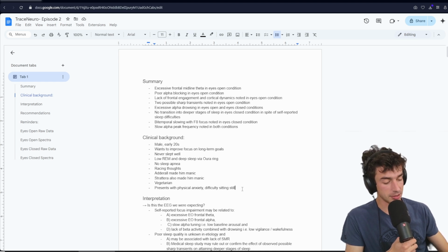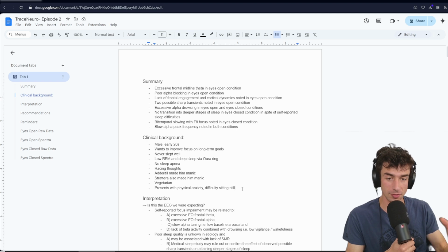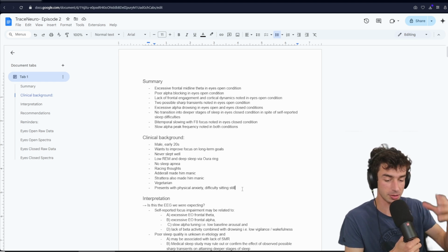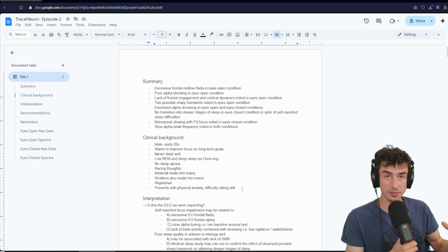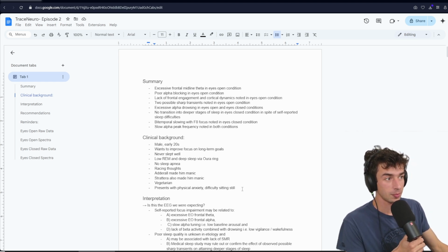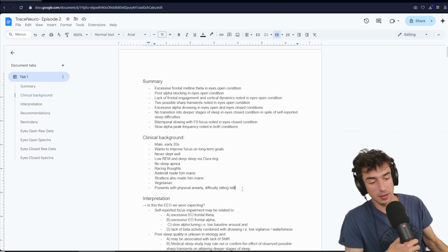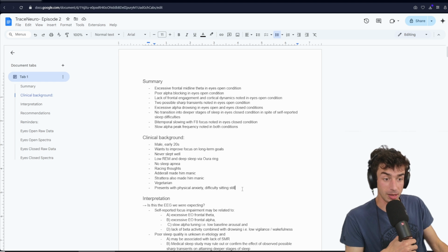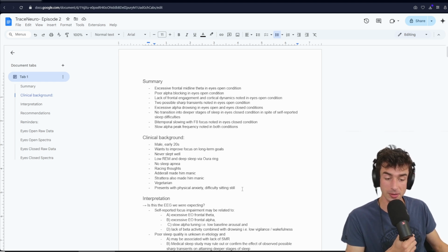And I remember Dave Seaver talking about this early on in my own EEG and neurofeedback journey, of seeing people with this kind of presentation where there might be too much alpha and/or theta up front, where they present as being very anxious, right? And the first thing we might think of as far as EEG correlates of that overarousal might be too much beta, too much fast wave activity.